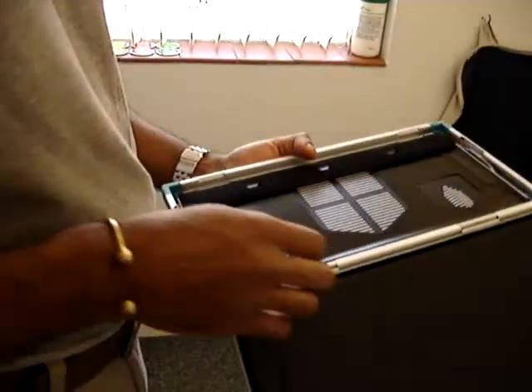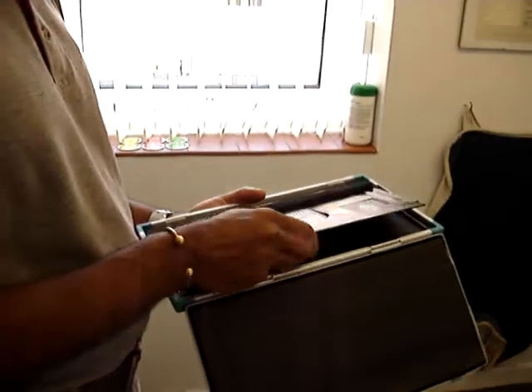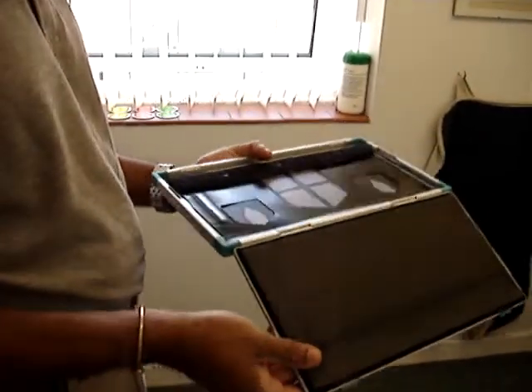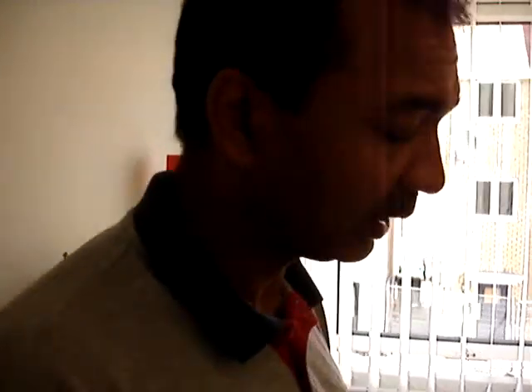You've got a little cassette there — this is the new digital cassette. It's a reusable envelope with the film inside it. Once the film's been processed through our computer, it goes back in here again and it's ready for use for the next patient. They are a bit expensive — the plate sells for about 500 pounds — but you use it 50 to 100 times, unlike before when you had to put a new film in every time.